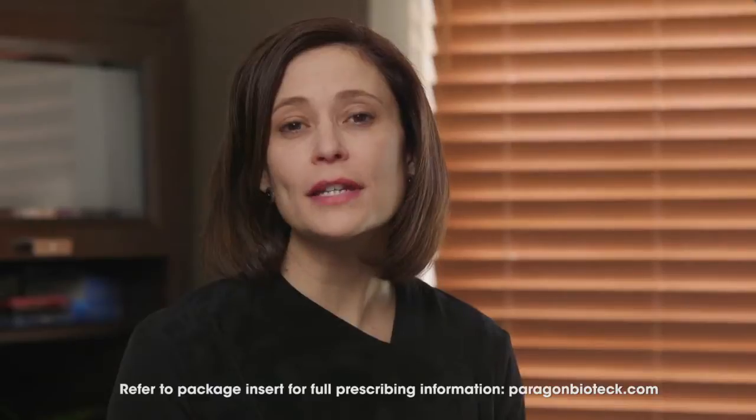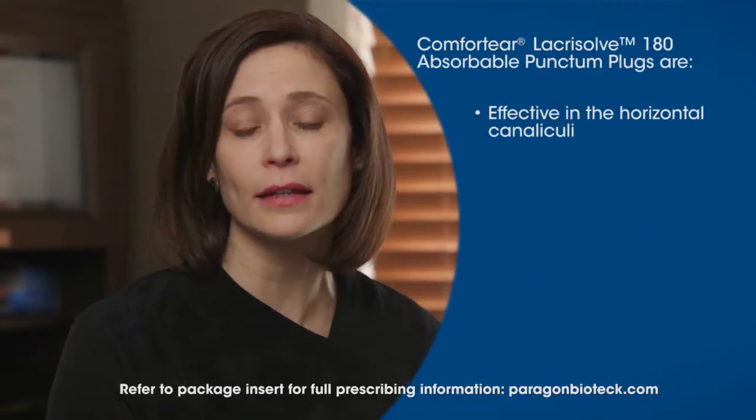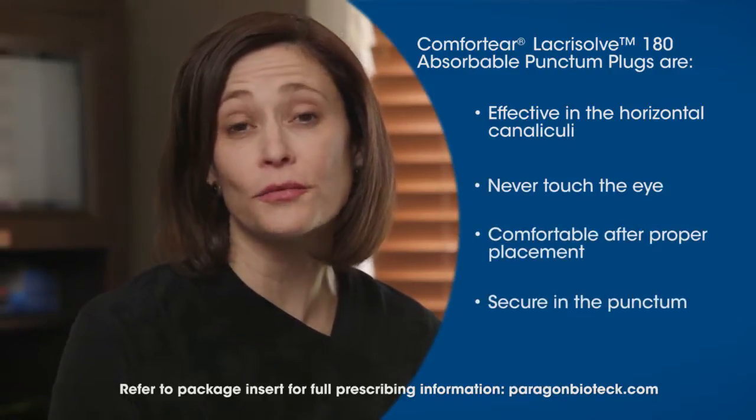I like Lacrizov 180-Absorbable Punctum Plugs because they are effective in the horizontal canaliculus. They never touch the eye, they're comfortable to the patient when properly placed, and they don't fall out.